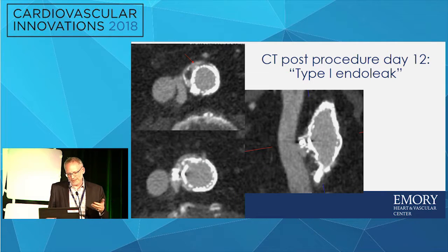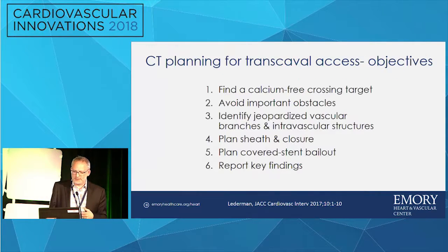Patient actually came back on day 12 with some back pain. Actually had nothing to do with anything, but we CT'd them. And this is the classic appearance of what that pouch looks like on CT scan. It's sort of a little endoleak. These all heal over time. This patient did fine, but you could predict that this was what the CT was going to look like, and you could predict this complication based on that.